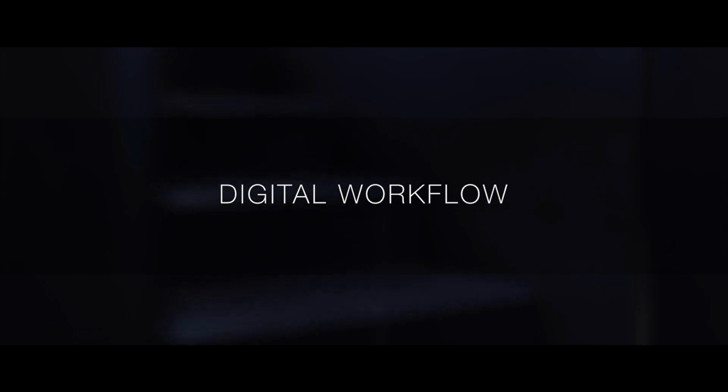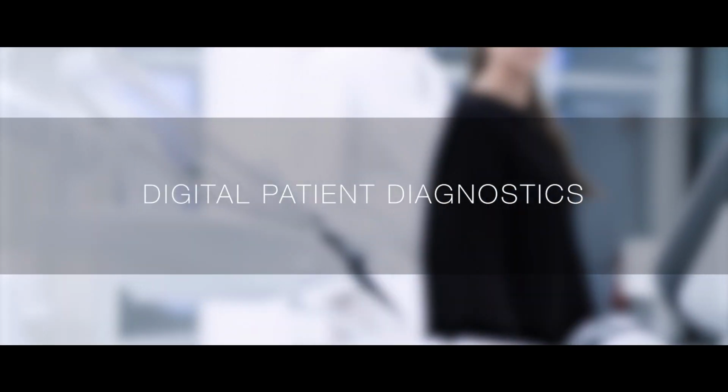Welcome to the Clinique de Medici by Zirkonzahn, our new education center, where dentists and dental technicians can learn our digital workflow by treating real patient cases.